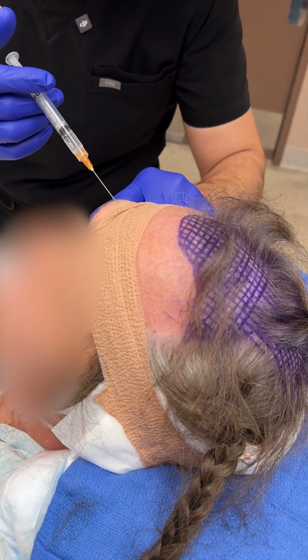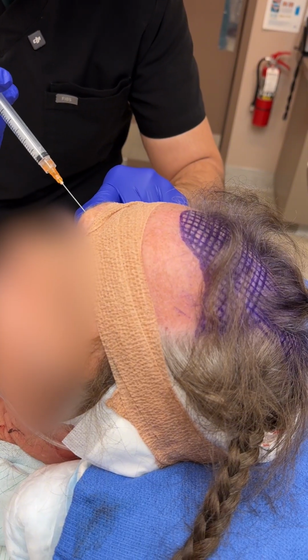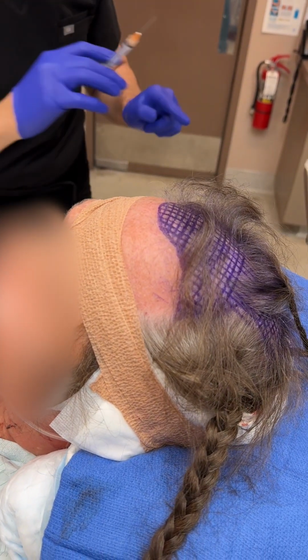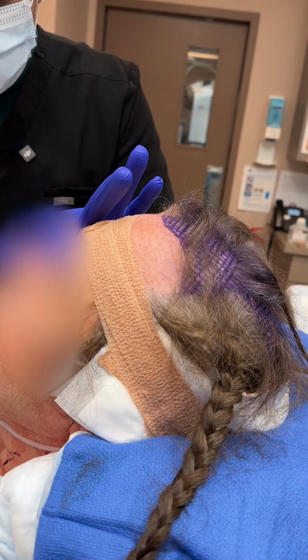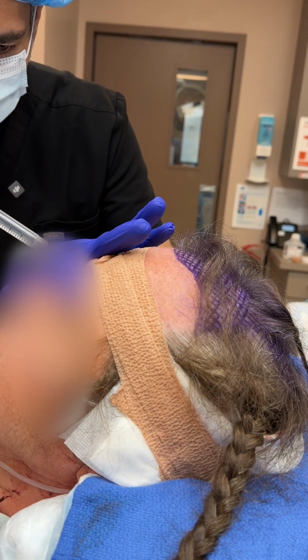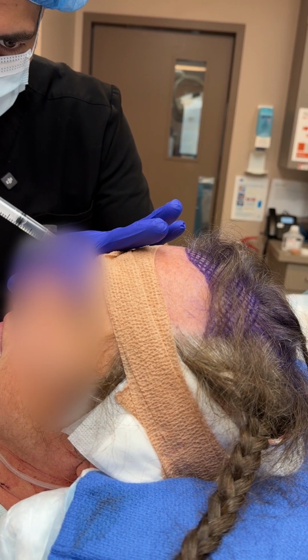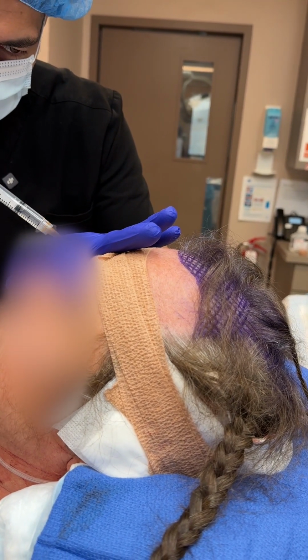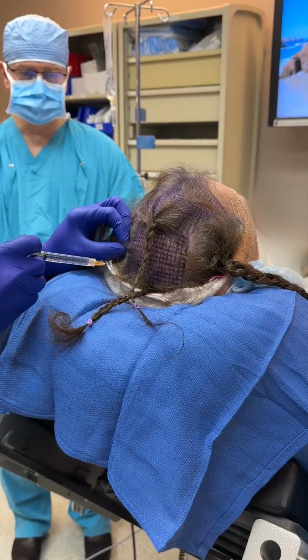Good. Now we're going to get the supratrochlear nerve. 1, 2, 3. Good. That's going to kick in over the next few minutes. Now we'll get the other side. 1, 2, 3. Great. Okay.